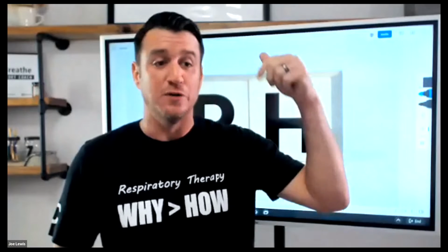Now, we talk a lot about blood gases when we're talking about adequate removal of CO2, but I think there is a huge opportunity for respiratory therapists everywhere to start to incorporate and better use things like end-tidal CO2, volumetric capnography, even transcutaneous CO2 monitoring, specifically in the neonatal and pediatric populations. Those are non-invasive tools that we can utilize to help us better monitor our ventilation of our patients.